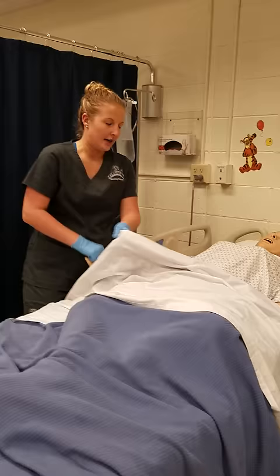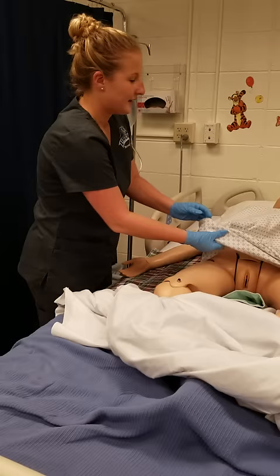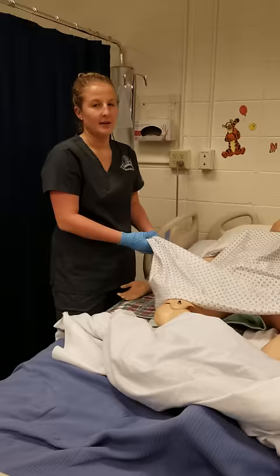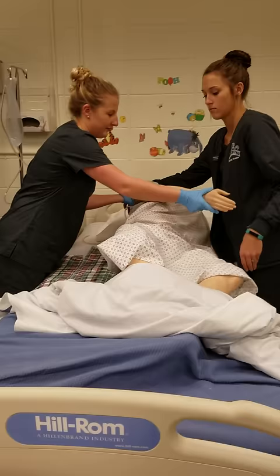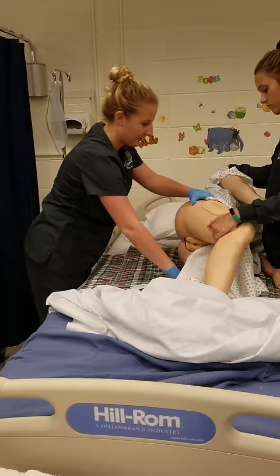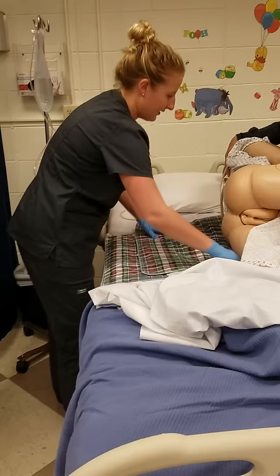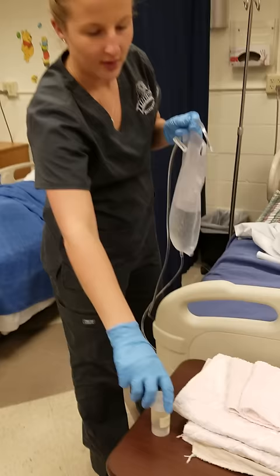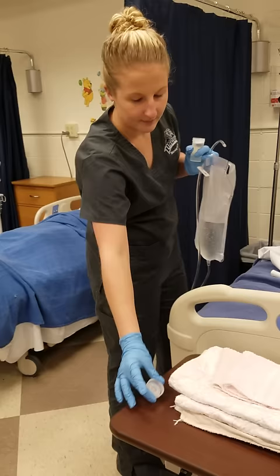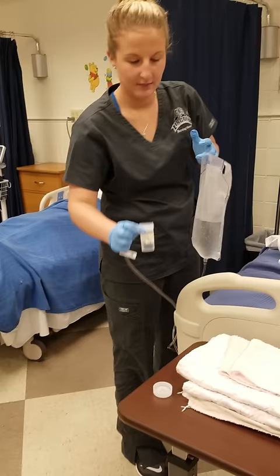I'll make sure they have a pad underneath them in case anything leaks out. I will then assess their mobility and see if they can get up to a bedside commode or if they need a bedpan. I will have all those supplies properly ready before we do the enema. I will then have them roll over on their left side with their top right knee bent and flexed forward. I will make sure pads are underneath them, then lubricate the tip of the enema. I will have a napkin ready for whenever we pull it out.